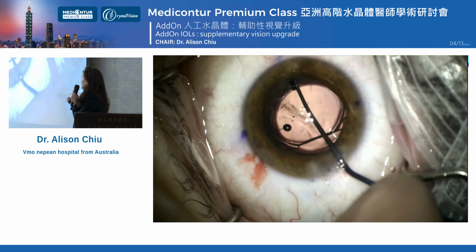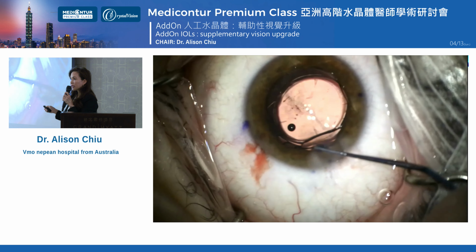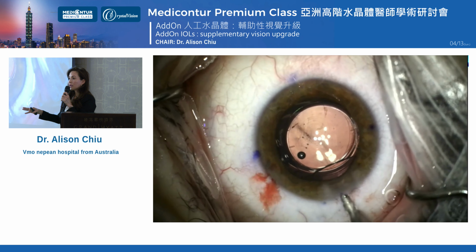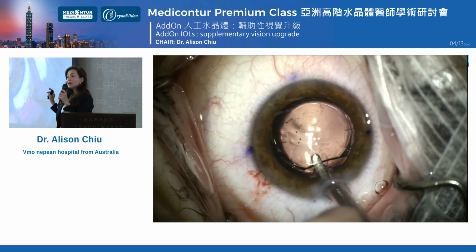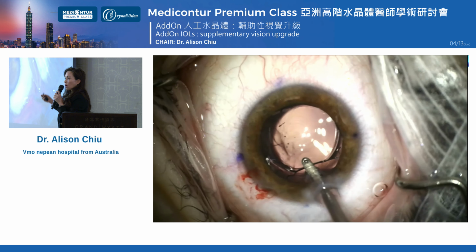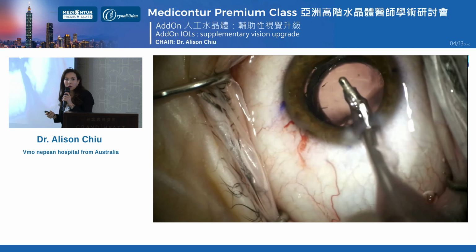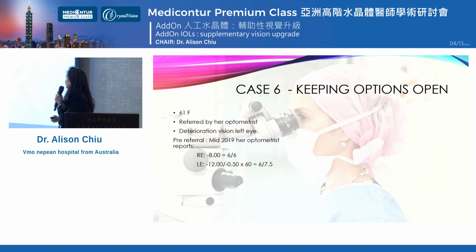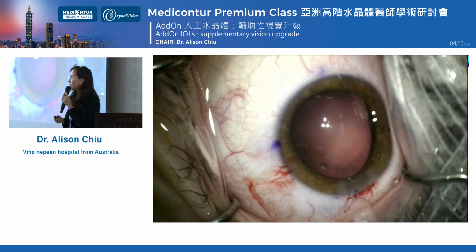So really the main issue here, once you remove the viscoelastic from in the bag IOL, of course, you put viscoelastic on top of your primary lens and in the sulcus, and it's about getting the viscoelastic out from underneath the add-on. So you've got to do that too. So as you can see, not hard. And I use a coaxial IA, but it would be even easier with a bimanual IA. So this worked very well, and we have not reversed her multifocality. She's done well in both eyes.